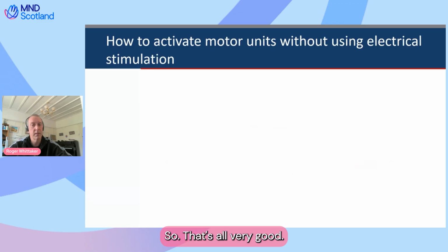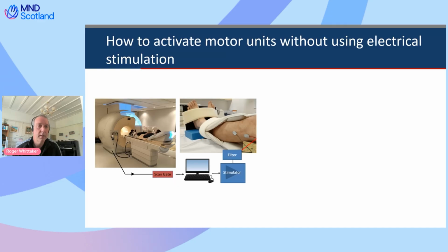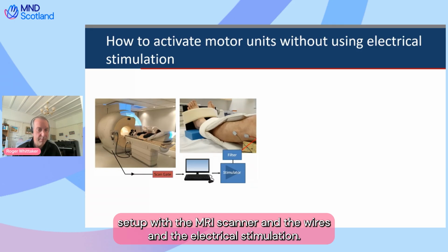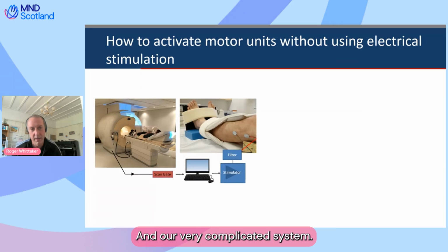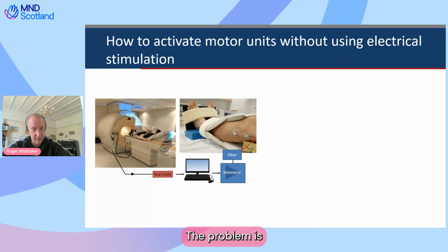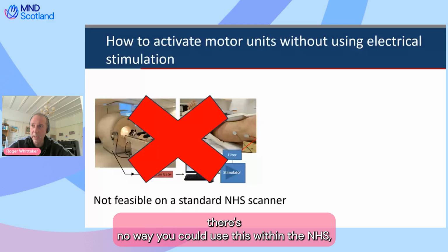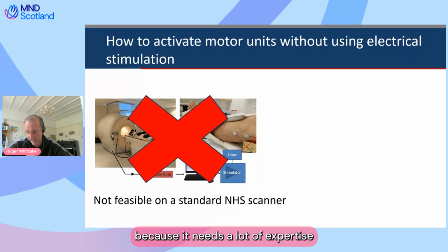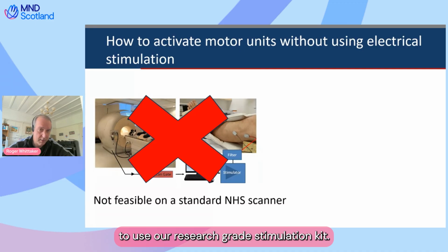So that's all very good. And we have to use our very, very complicated setup with the MRI scanner and the wires and the electrical stimulation and our very complicated system. The problem is there's no way you could use this within the NHS because it needs a lot of expertise to use our research grade stimulation kit.